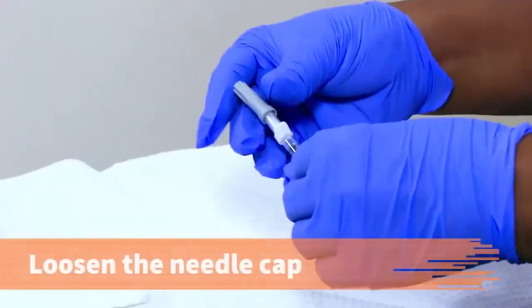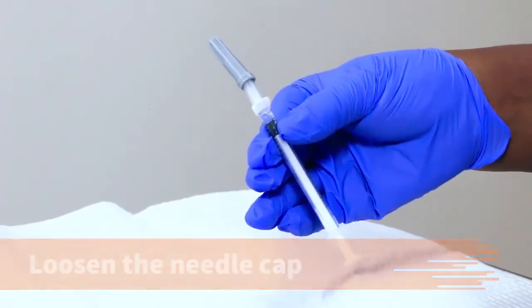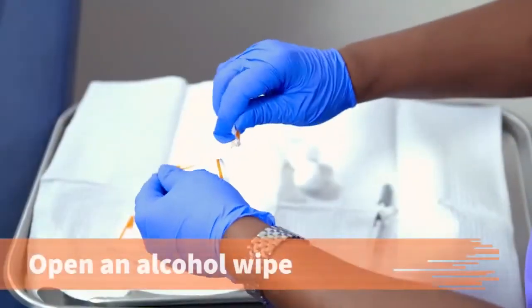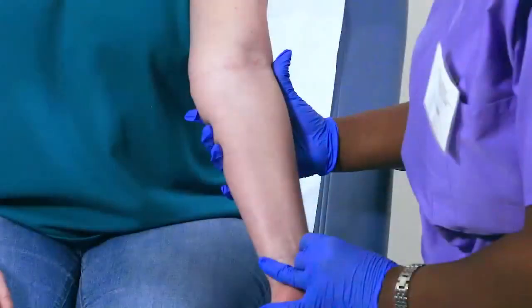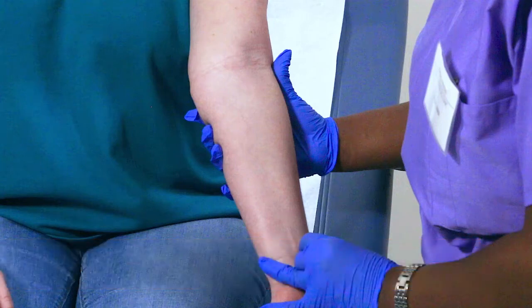Loosen the cap on the needle so that you'll be able to open it with one hand once you clean the injection site. Open the alcohol wipe. Place your non-dominant hand on the back of the patient's forearm to pull the skin taut. Another option is to wrap your thumb and the first 2 fingers of your non-dominant hand around the patient's forearm, pulling downward and apart to stretch the skin taut at the location of the injection.